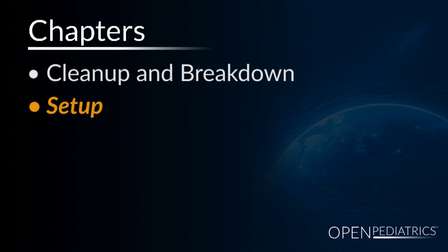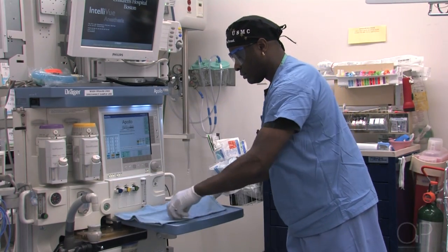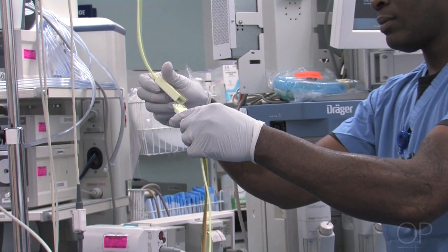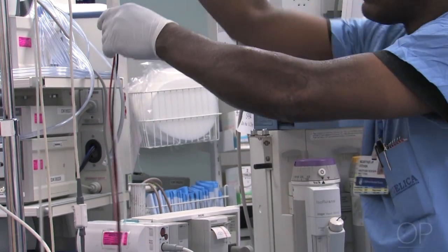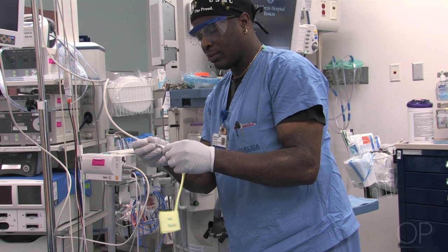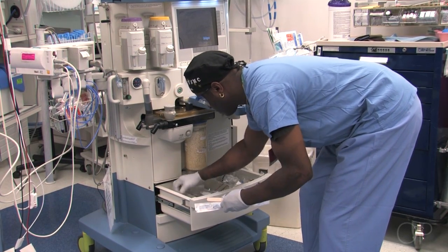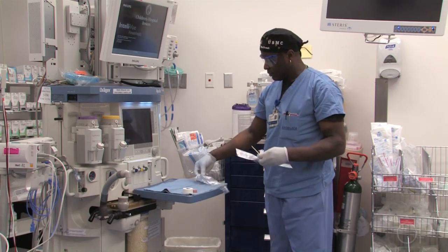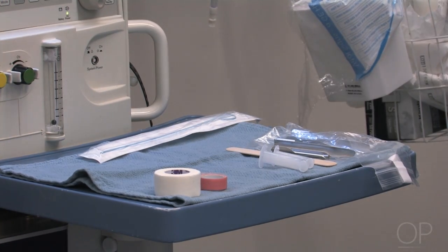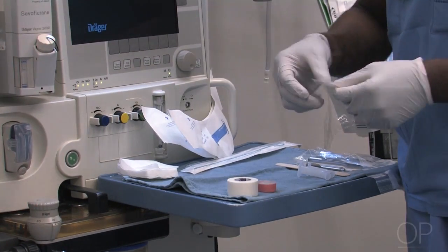Setup begins. We start with the blue towel. All appropriate new items are placed: ECG cables, blood pressure cuff, and then the intubation items — laryngoscope blades, tongue blade, stylet, oral airways, appropriate size endotracheal tubes, 3x3 sponges, and an eye guard.